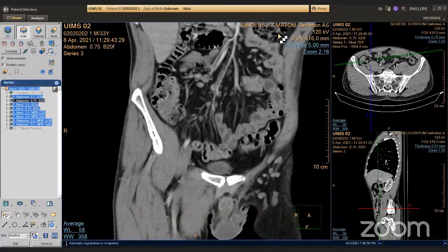Okay. I think somebody's just asking, do you measure the lymph nodes on the short axis? Yeah, okay, there is a question. Thank you, I missed that. That's quite an advanced question. If you measure lymph nodes, you should measure two dimensions, because whether they are oval or round is important for the diagnosis. But officially, you should measure the short axis, yes.